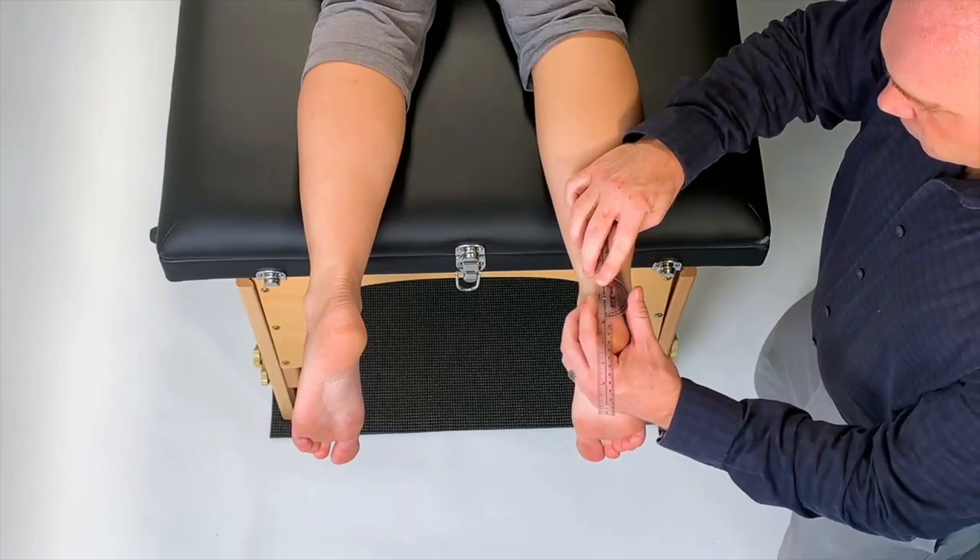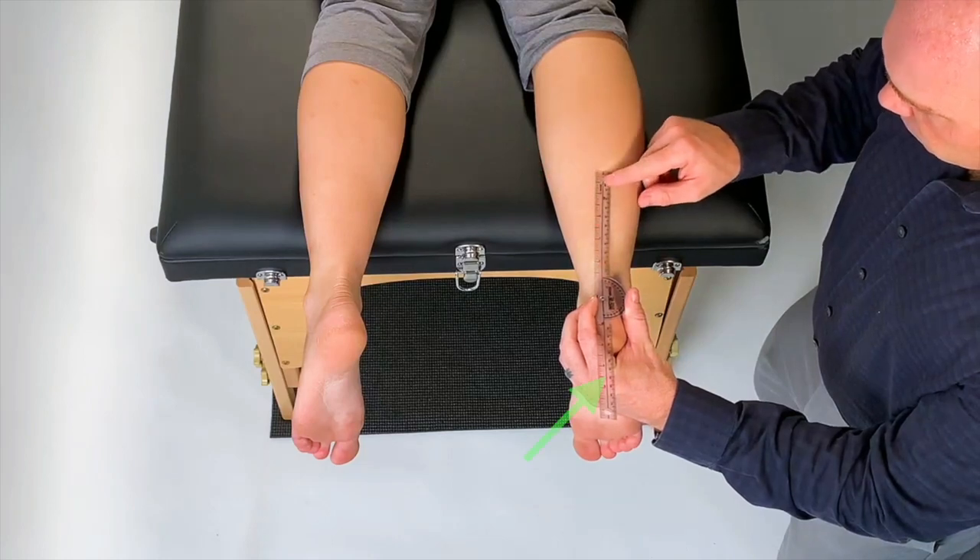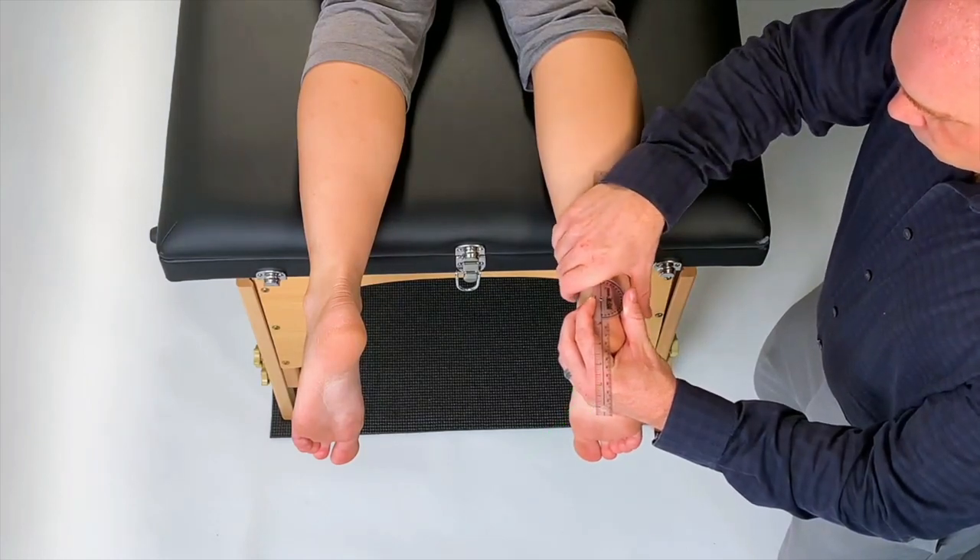Now line your goni up with the ankle by placing the axis at the proximal dot, the stationary arm at the midline of the patient's leg, and the movable arm aligned with the distal dot.